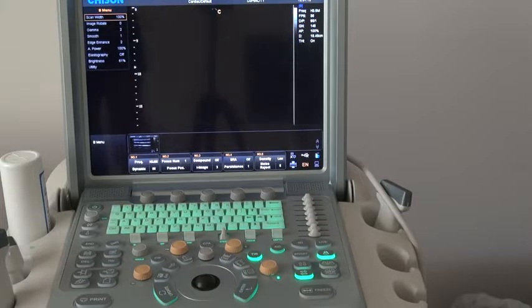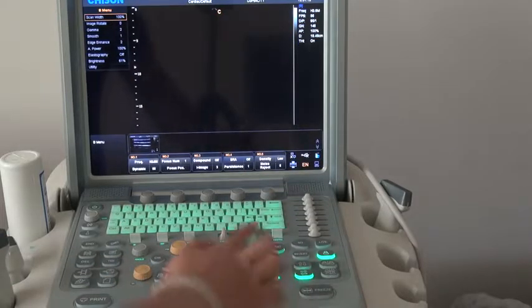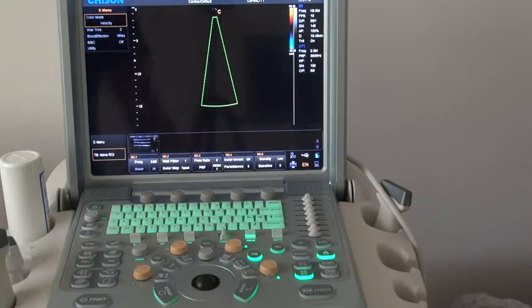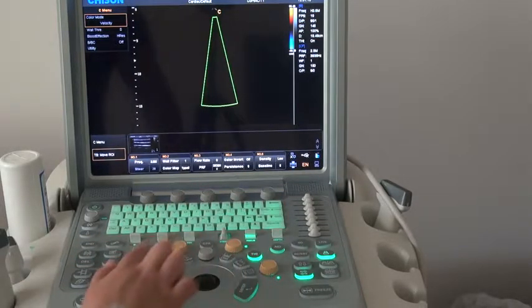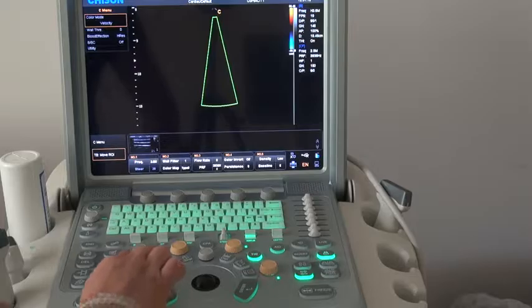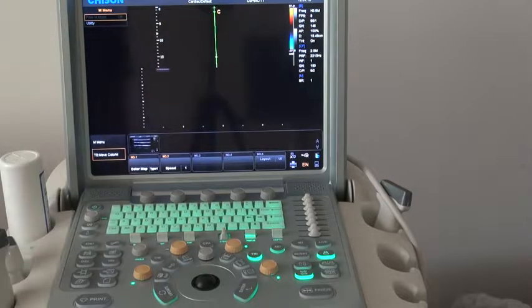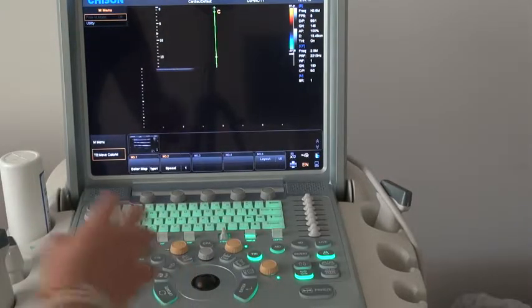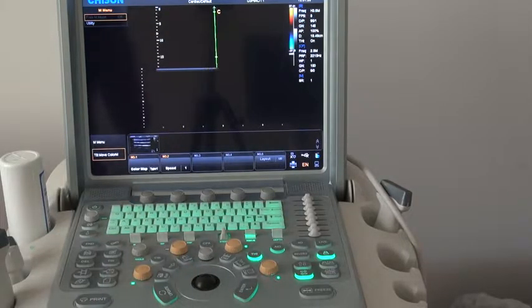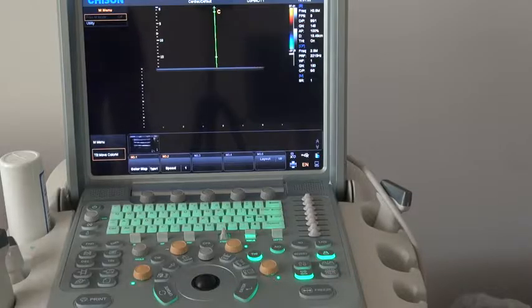After that, go back to B mode. Press the C key to go into C mode and press the M key to go into color M mode. You will find the color and the M waveform can be displayed on the screen at the same time.